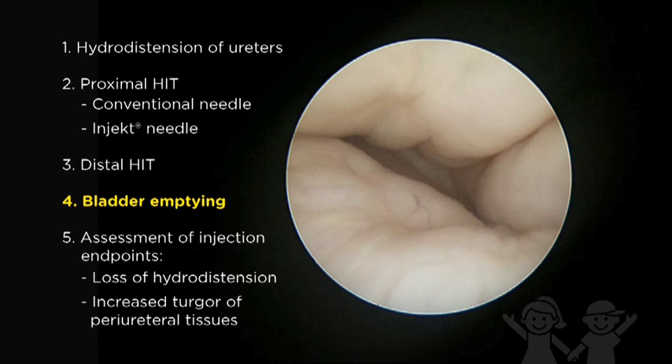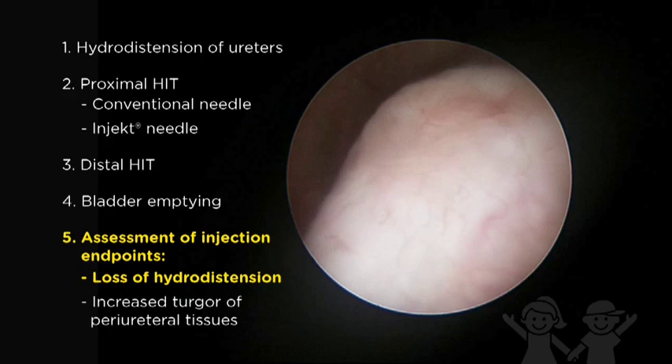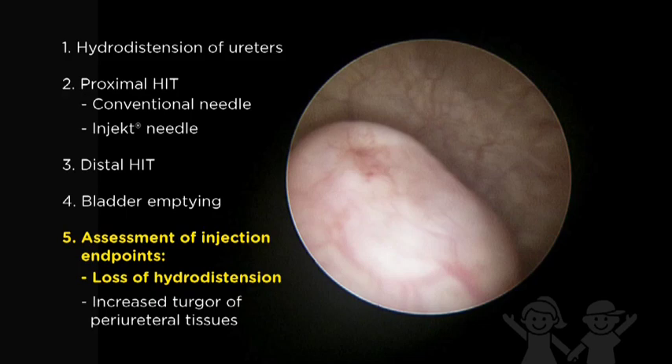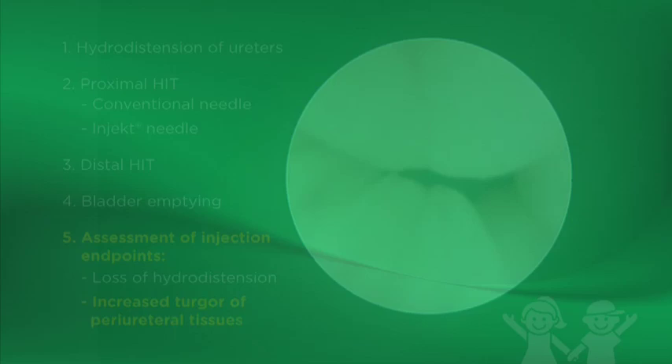Hydrodistension with the bladder nearly empty is performed following each injection to monitor progress. Additional injections may be needed to achieve an H0 ureter during hydrodistension. Objective endpoints of injection are the loss of hydrodistension with the bladder empty and increased tissue turgor. The needle is used to depress the implant; poor turgor will result in deformity of the implant, indicating that more volume is needed.